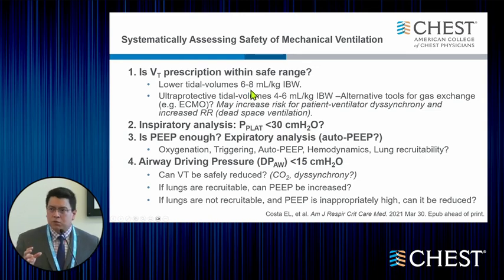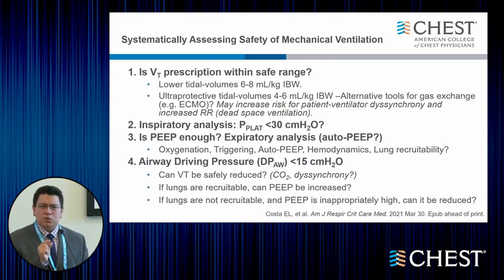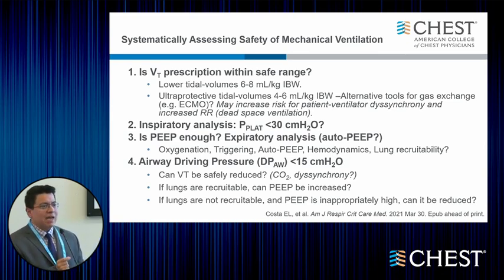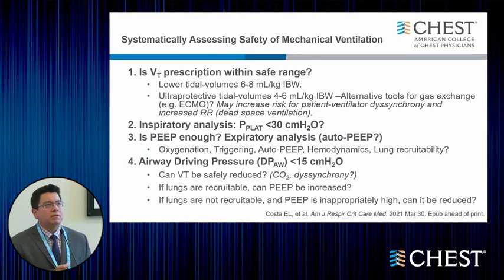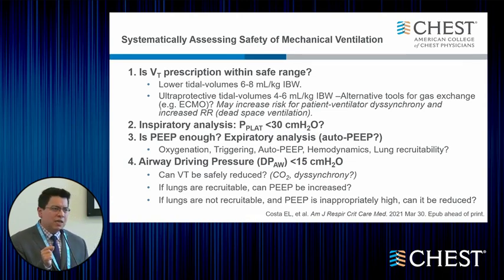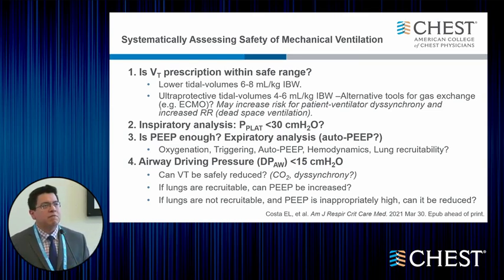The ultra-protective tidal volume strategy that is also supported by evidence includes 4 to 6 mL per kilo of ideal body weight. This was initially conceived to be used with alternative modes of gas exchange, such as extracorporeal gas exchange methods. And it's important to keep in mind that if that calculation is getting closer to your anatomic dead space, then that may actually compromise your minute ventilation significantly.